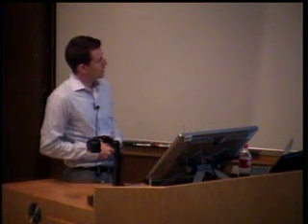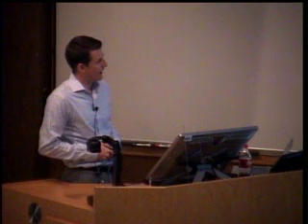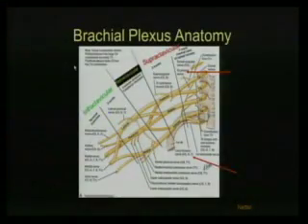So if you have a lesion, let's say it's a metastasis, and you see the fat between, all the white here is fat, and then these circles are the nerves. If you see some blurring of that fat or abnormal signal or mass effect, you could tell the clinician it's supraclavicular, probably getting C5 and C6, and see if that matches up. And that's really all you're trying to do, is find the abnormality and do the best you can to help them localize.